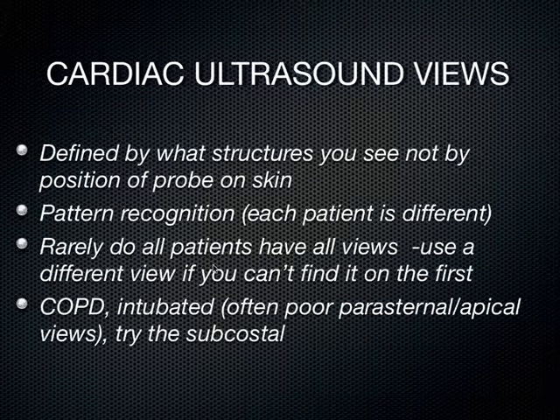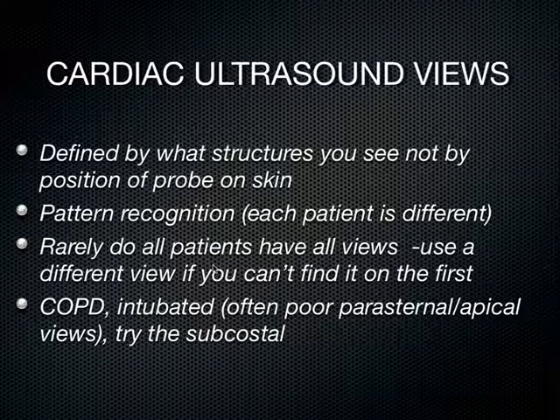And so remember that these cardiac views are really defined by the structures that you see on the screen, not necessarily by those areas I just pointed out to you on that last diagram. So this is where there's a lot of art. Everybody has a different shaped chest wall, and you really need to work to get these views in. A lot of this is pure pattern recognition.